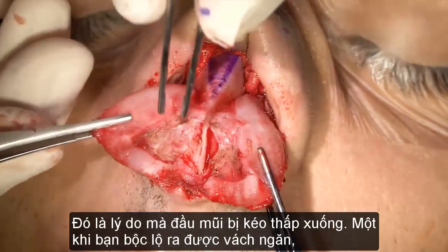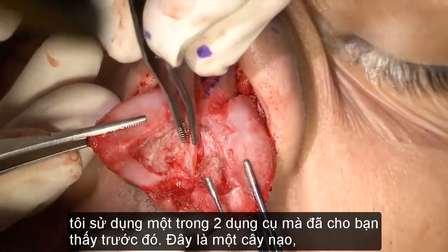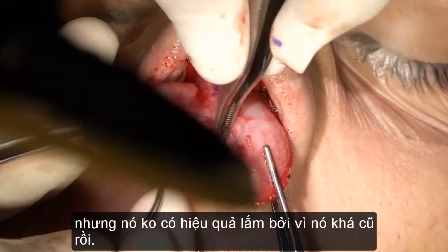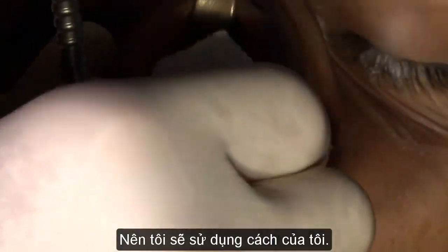So once you have your septum exposed, I use one of these two instruments I showed you before. So this is the one that is a scraper, but it's not very efficient since it's kind of oldish. So I will get to mine.